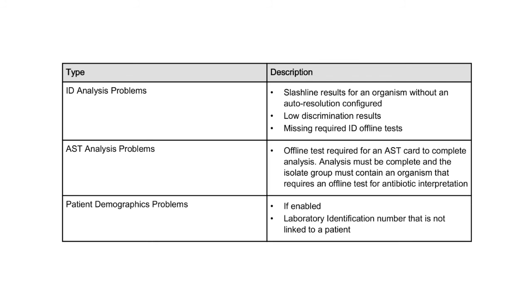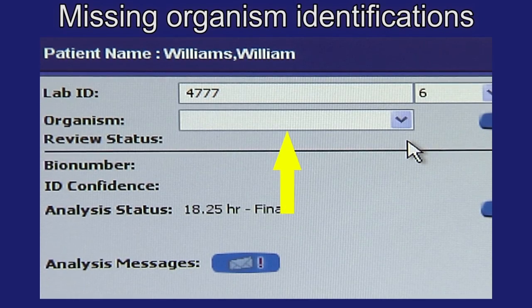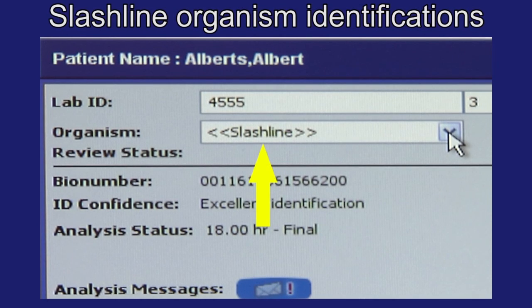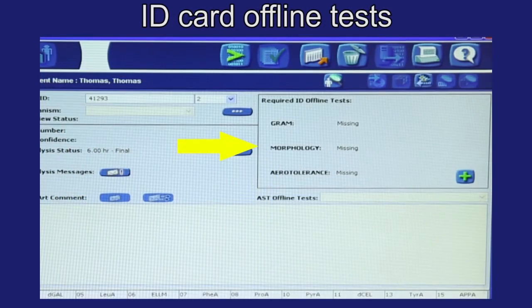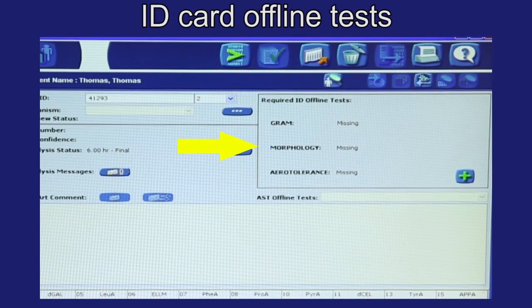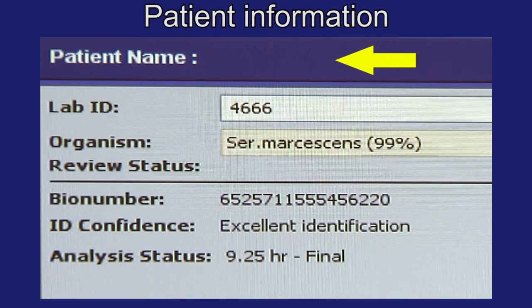Characteristics that trigger qualified status include identification (ID) problems, antimicrobial susceptibility testing (AST) problems, and patient demographic problems if patient demographics is enabled. Essentially, a qualified isolate is one that is missing required information. Specific examples of missing information include missing organism identifications, slash line organism identifications, low discrimination identifications, ID card offline tests, beta-lactamase test, and patient information.